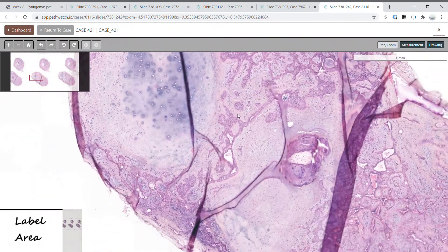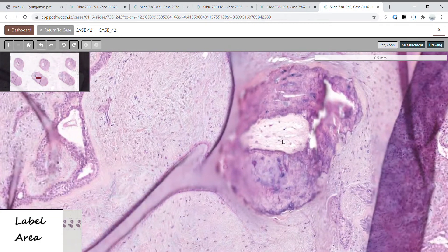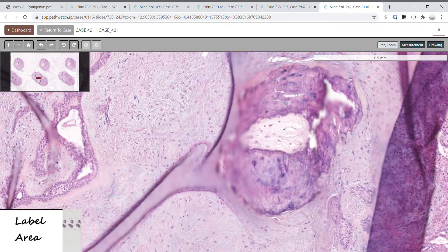This case also shows another finding: bone formation. This is calcified bone.